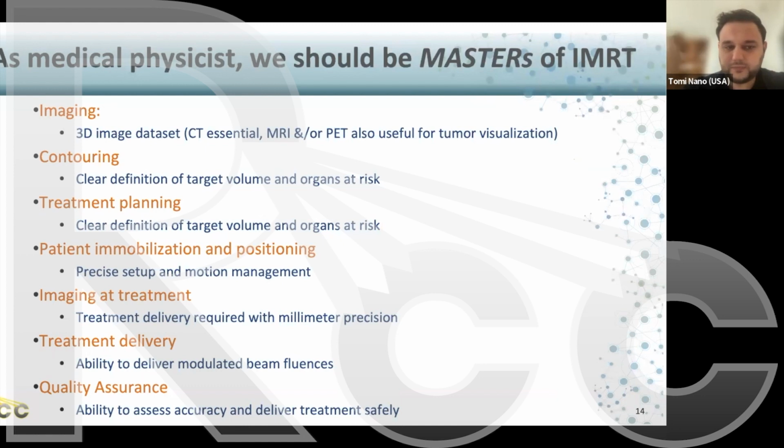So imaging is very important, and it comes up a lot. So treatment planning, simulation, patient setup, those are some cases when imaging comes up. And there's a famous quote that says, if you can't see it, you can't hit it. And I think that really illustrates the importance of imaging, because even though we have this fancy tool and treatment machine, we still have to see what we're hitting and know where we're delivering it.